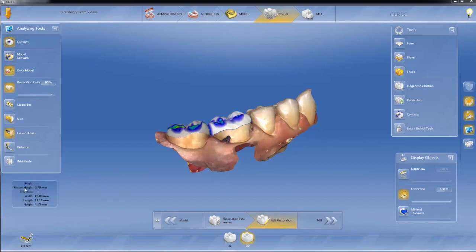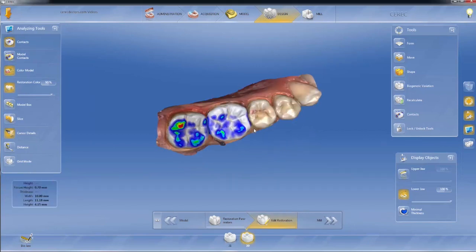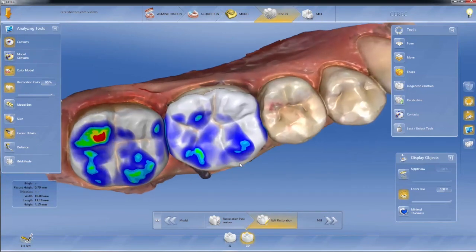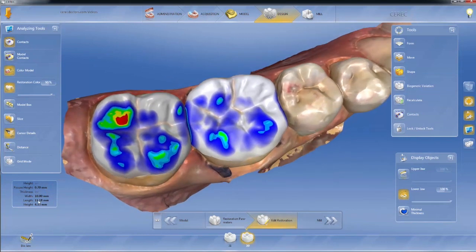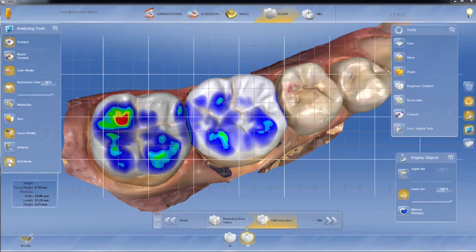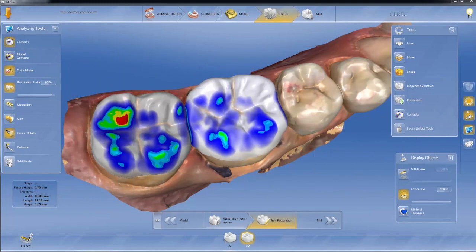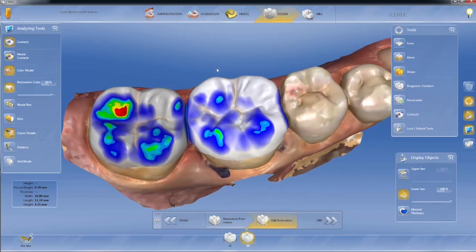We have our cursor details, which give us the restoration information. One nice thing, which is really helpful on anteriors, is it tells you the width, length, and height of the restoration. So when you're doing an anterior tooth and you've got two central incisors that need to be symmetrical, this tells you the size of those restorations. In the previous version we had to hit Control-G to get grid mode; now we have grid mode that we can simply turn on and off.